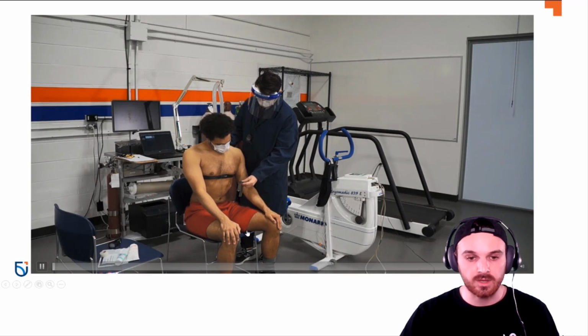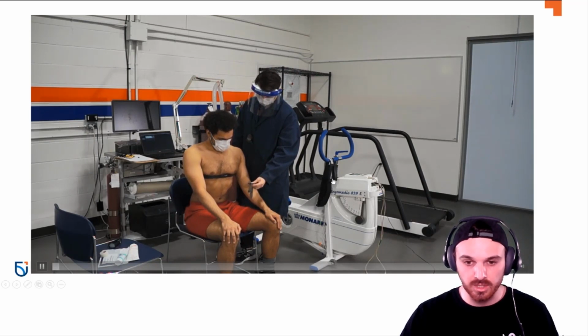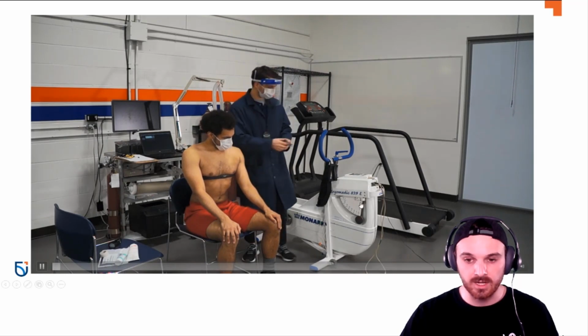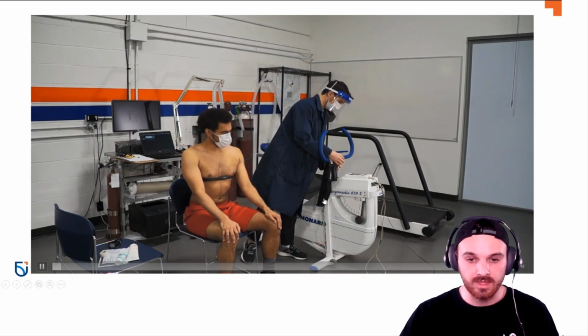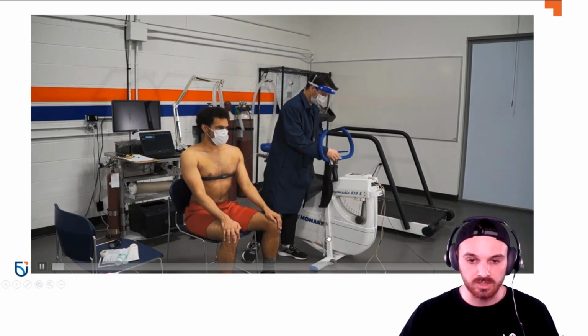You can see I'm setting up the heart rate monitor. So he has the heart rate monitor strap on. I'm setting up the watch, just making sure that the watch is on the bike before. You can see that we have our blood pressure cuff set up there and ready to go. And then we also have our Physioflow in this little pocket here. And you can see the electrode leads dangling there.